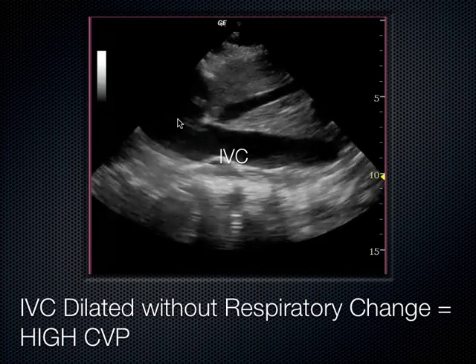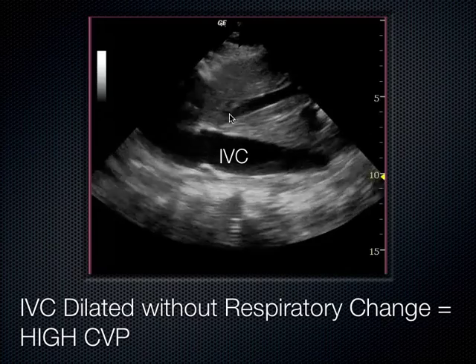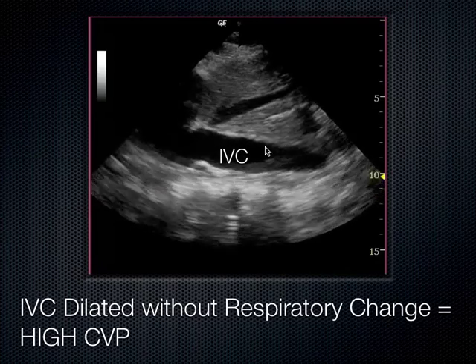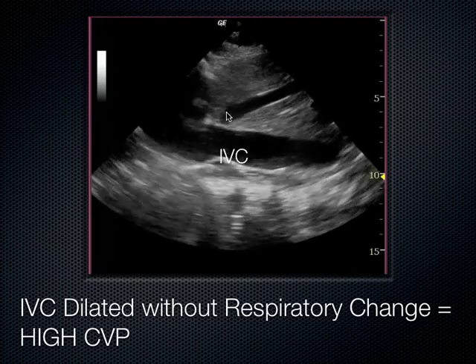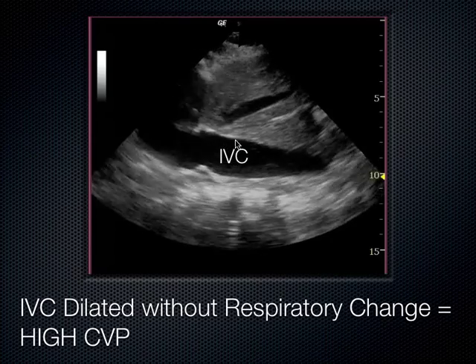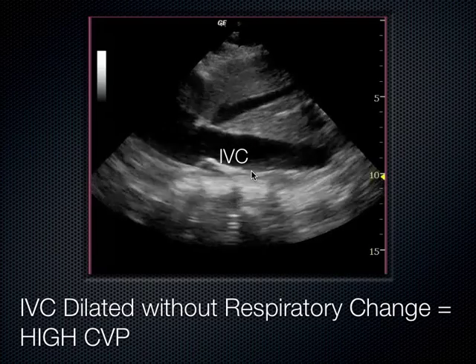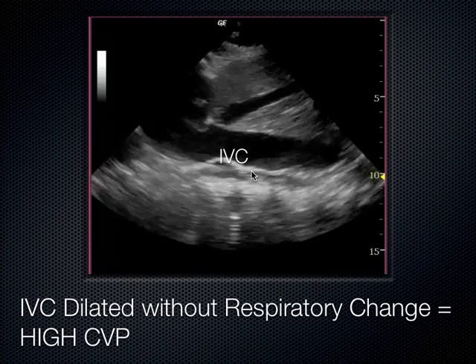This is the heart right here. This is the right atrium of the heart. Here's the IVC coming across the screen underneath the liver. This is the hepatic vein right here. People always say, well, where do I measure the IVC? Over here, over here, over here. Hotly debated topic. Probably 2 centimeters distal to where the hepatic vein dumps into the IVC. So that would be maybe around here, where most people agree to measure the IVC diameter. Just throwing this out there. It's going to come up over and over and over again. I want you guys to be aware of it and how powerful that can be.